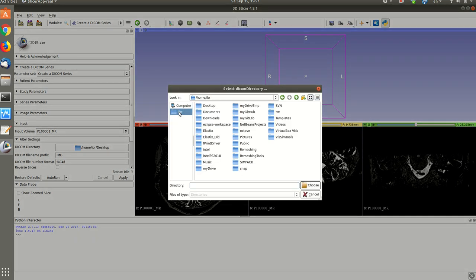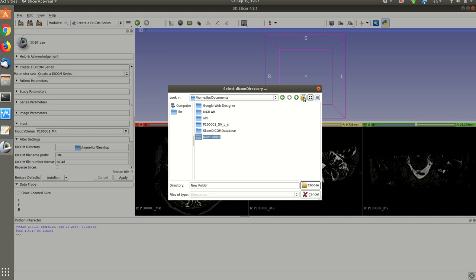Then you select where you're gonna save it. Let's say I'll put it in documents. I'll call it MRI DICOM for example. Then choose.